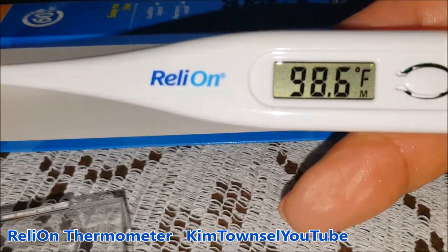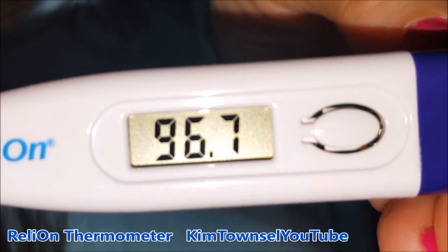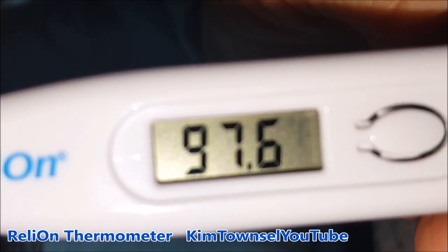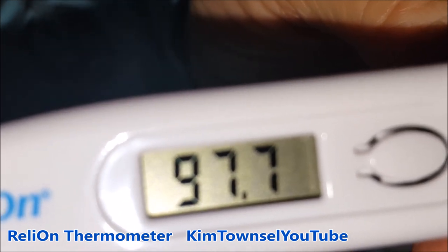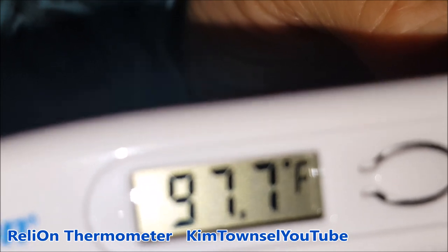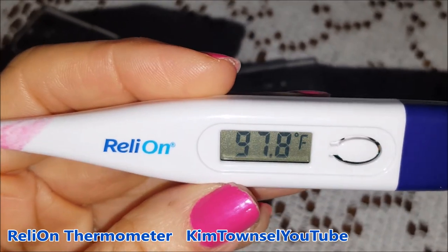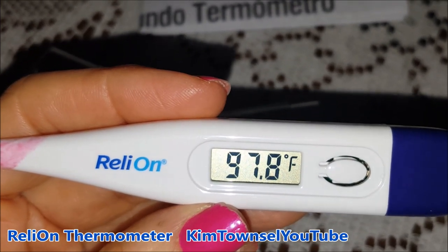Now I'm going to show you the thermometer in action for the first time. This is real time — I'm not speeding it up so you can see how long it takes to get a temp reading. There were your 10 beeps and mine's 97.8. My temperature is always below 98.6 — always. So if mine says 98.6, it means I have a fever.